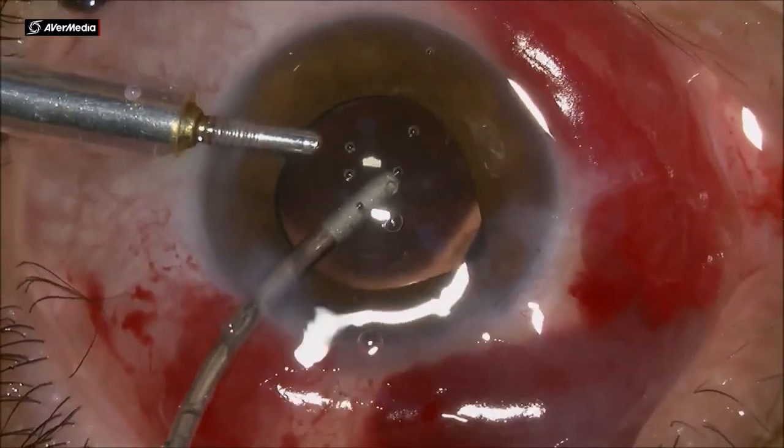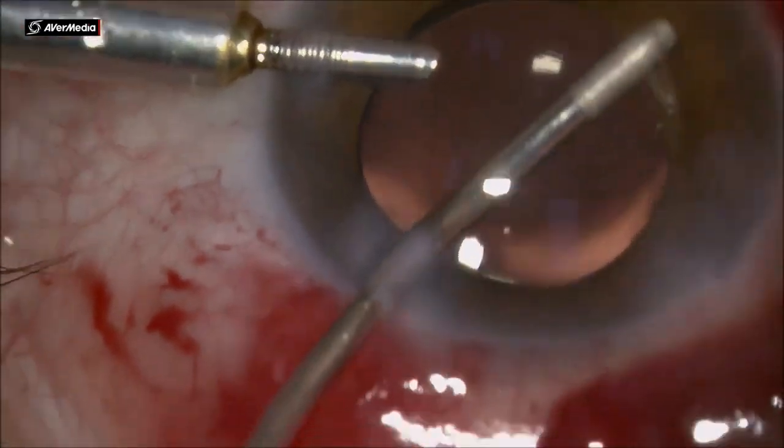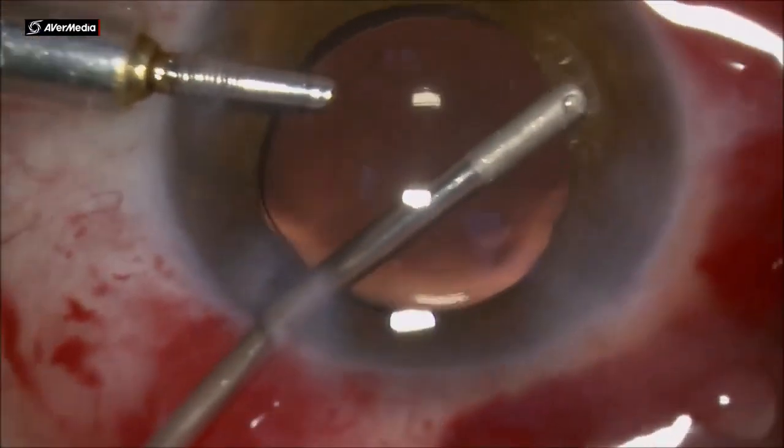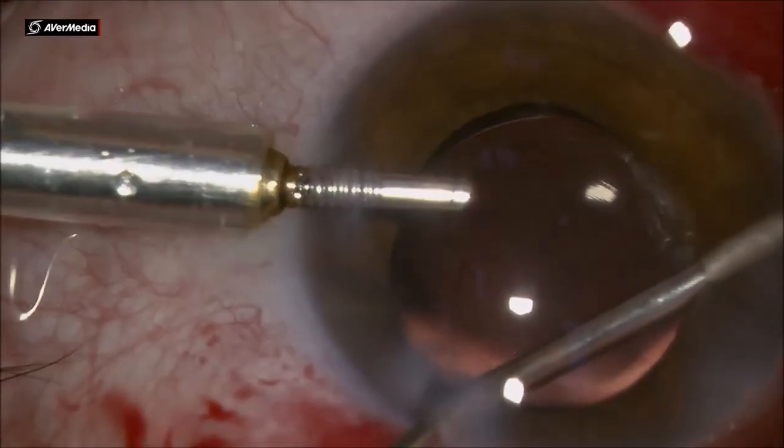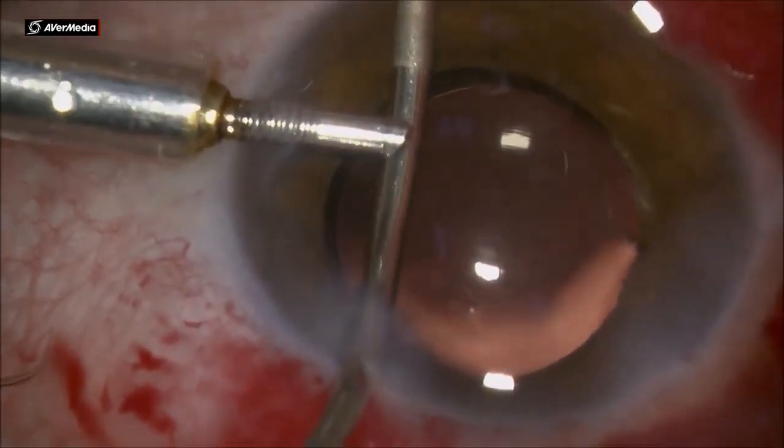Washing out any viscoelastic, pushing down the iris root to break the anterior synechia. This will take care of the IOP post-op, injecting some intracameral antibiotic, and that's the end of the case.